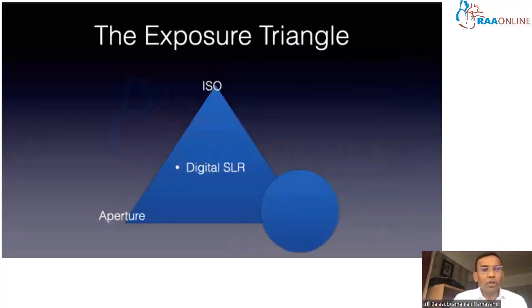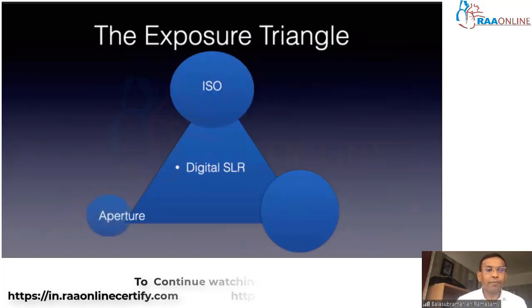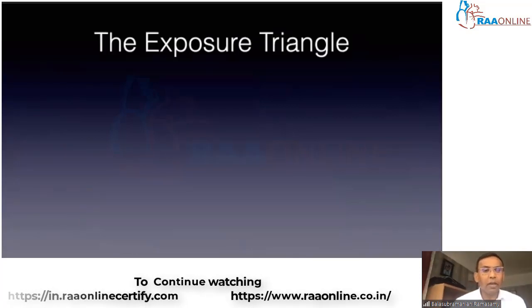While it's all very intuitive with the recent digital single lens reflex cameras, it's useful to think about some of the important parameters that can be controlled in order to achieve high quality imaging of anterior segment using the digital SLR cameras. The commonly quoted triad, that's called the exposure triangle, includes the ISO standard of films or sensors, the aperture opening size, and the shutter speed. Now, let's look at all of them in a bit more detail.